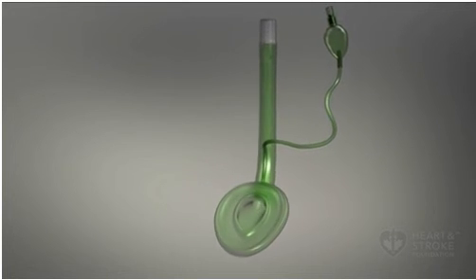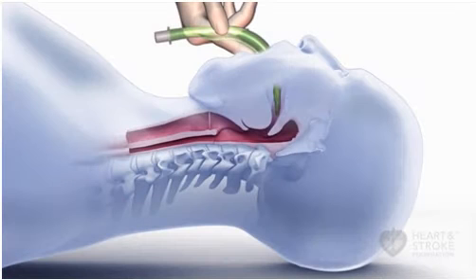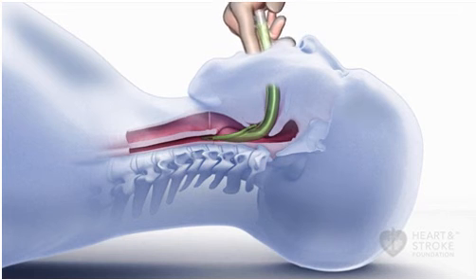the patient's hypopharynx. Place the laryngeal mask airway in the open mouth with the opening of the mask facing the patient's tongue. Advance the device to the back of the tongue. In a smooth motion, use your index finger to press the laryngeal mask airway against the roof of the mouth and guide it downward. Continue advancing the device until you feel resistance, which indicates the distal end of the tube has reached the hypopharynx. Withdraw your finger and inflate the mask.